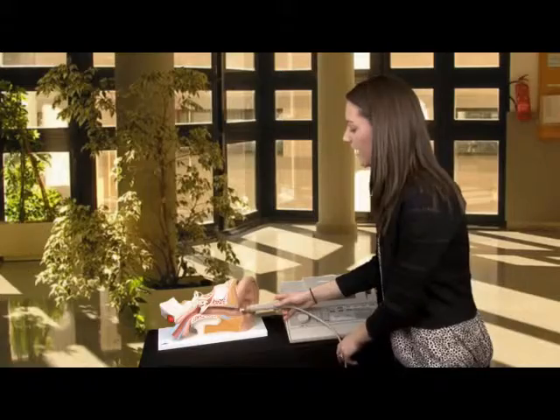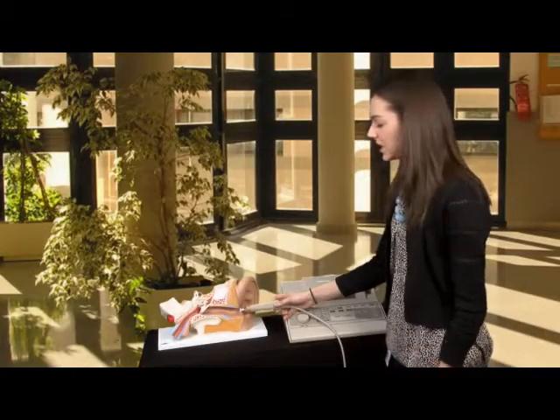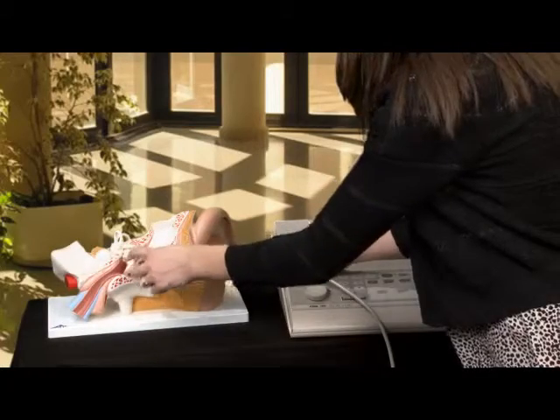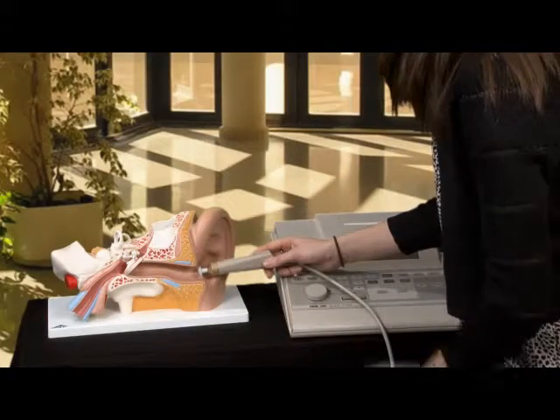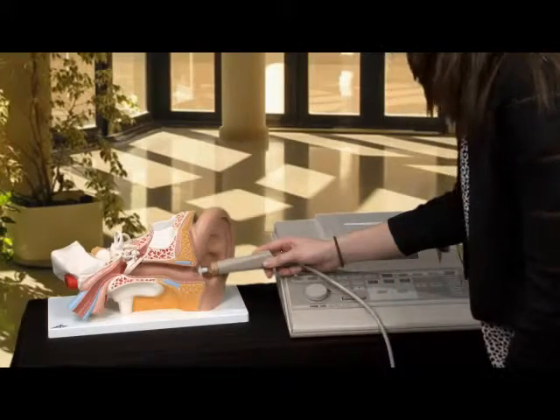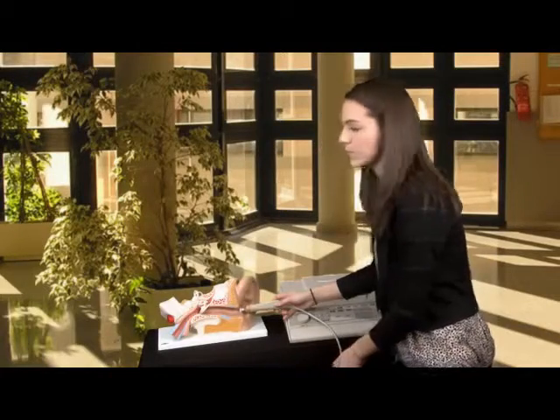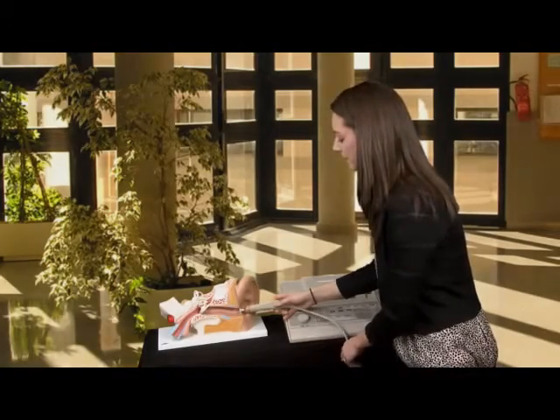On the other hand, if we had a pathology such as a break in the ossicular chain, more of that sound energy would be absorbed and less sound would be picked up at the microphone.